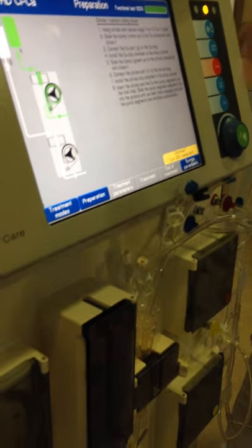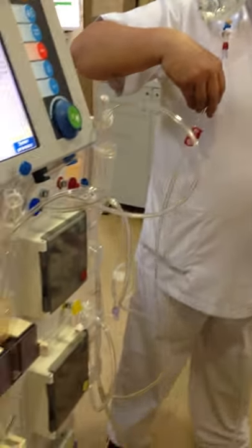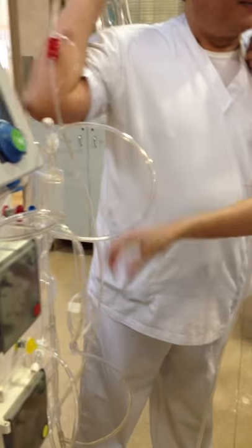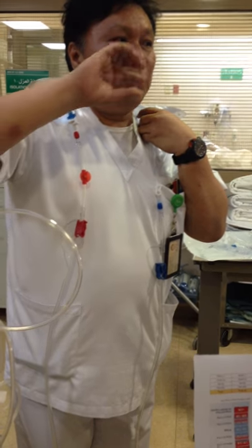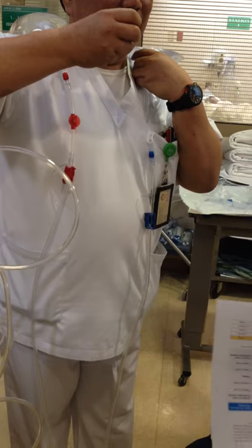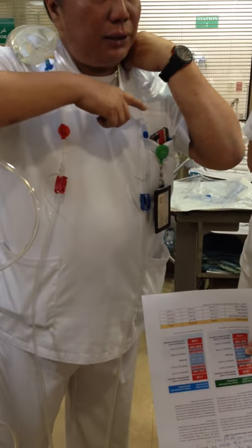Now stop at this stage a moment. If you notice, this is your arterial. As the blood comes out, what is infused? Citrate. So what does the citrate do to the blood? Chelate, to make it an anticoagulant, right? Chelating. You understand now? When is calcium infused? At which point?